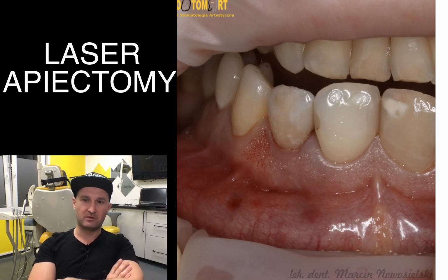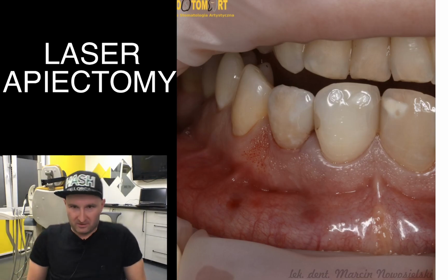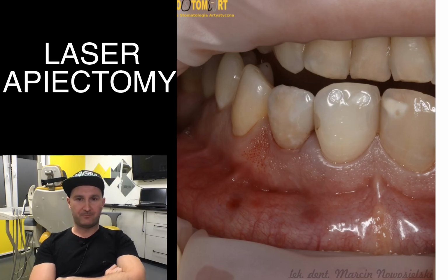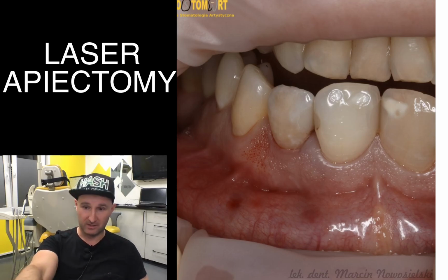The patient knew about it because we agreed on it at the consultation. So it was all done in one session after we finished the root canal treatment protocol, and after the chamber was closed, we removed the rubber dam, and during the same anesthesia we started the surgical part.